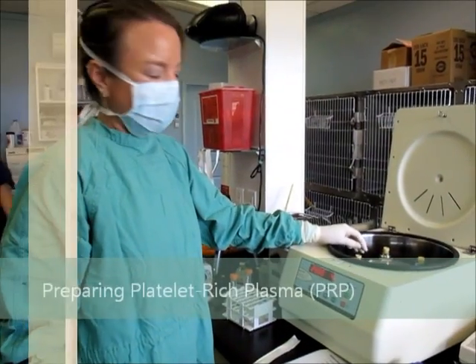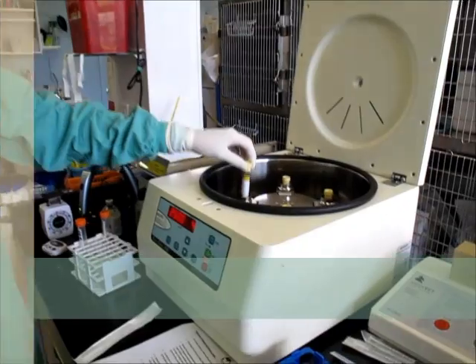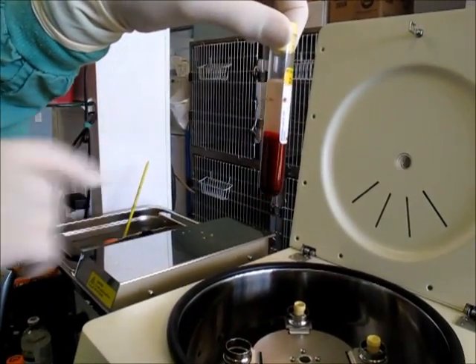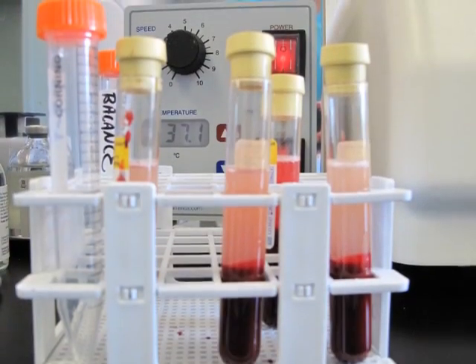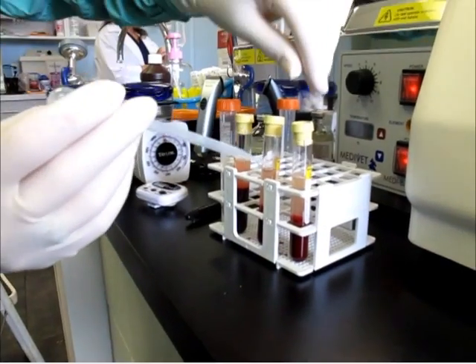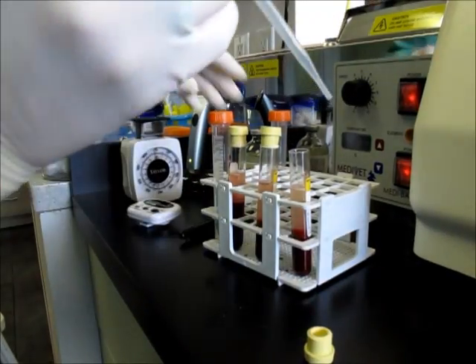We took the blood samples and spun them down for 4 minutes at 2500 RPM. Here you can clearly see the heavier red blood cells and the plasma on the top. Now I'm going to take the plasma off of all the tubes and combine it into one tube.